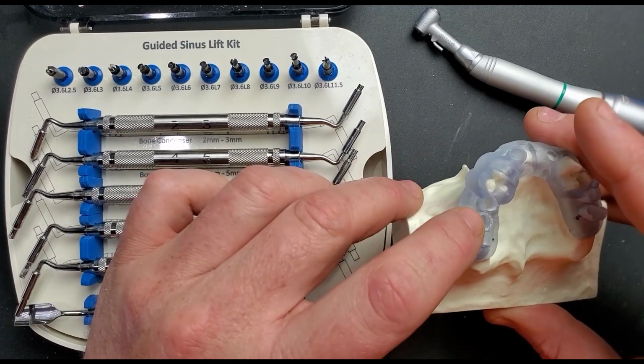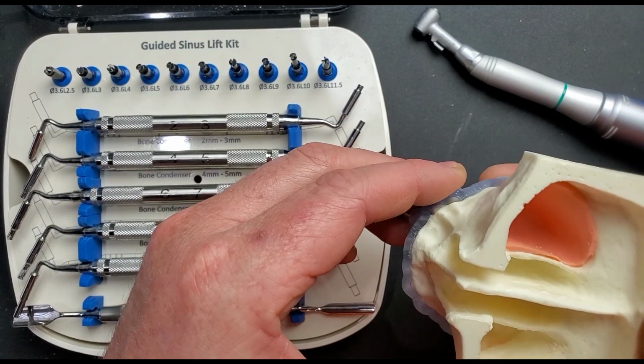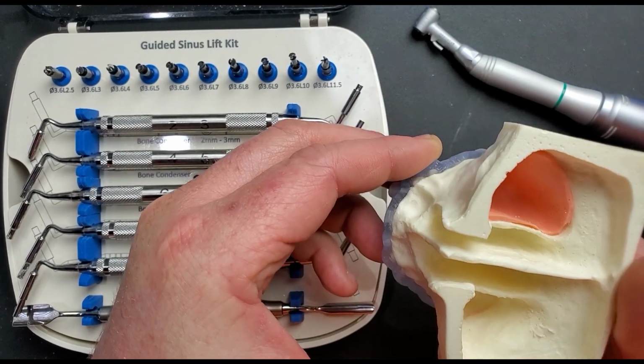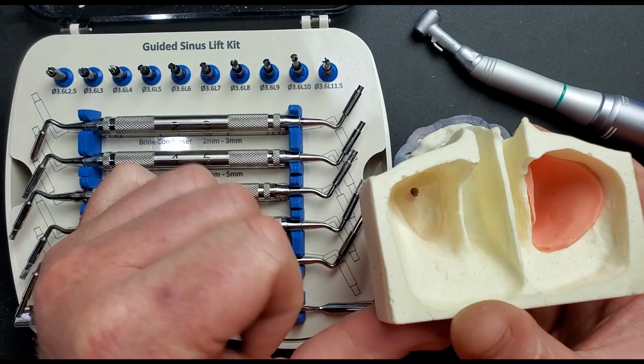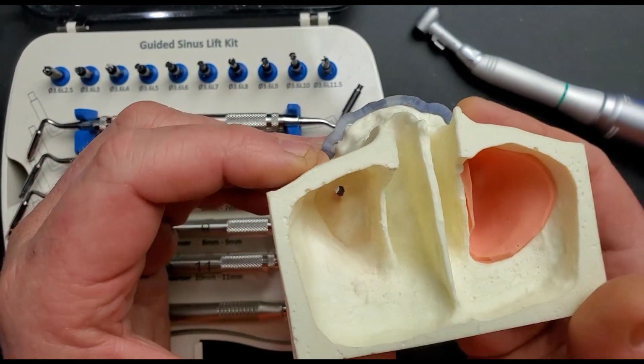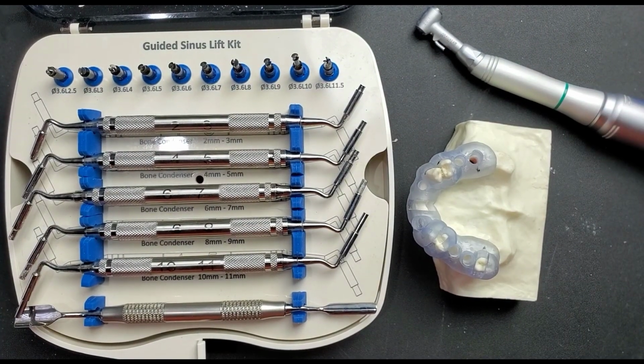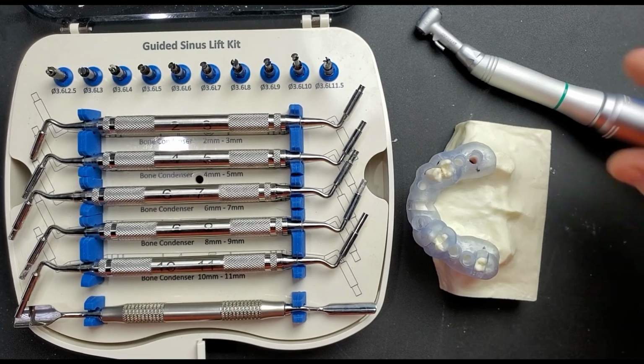We're going to be placing an implant in this site, and it measures about 8 millimeters from the crest of bone up to the sinus floor. And I've removed the sinus membrane on this side so I can kind of show you what these drills are looking like as they're approaching that sinus. So always start by measuring your vertical bone height so that you know when you need to really slow down and try to start discerning when you've breached that sinus floor.